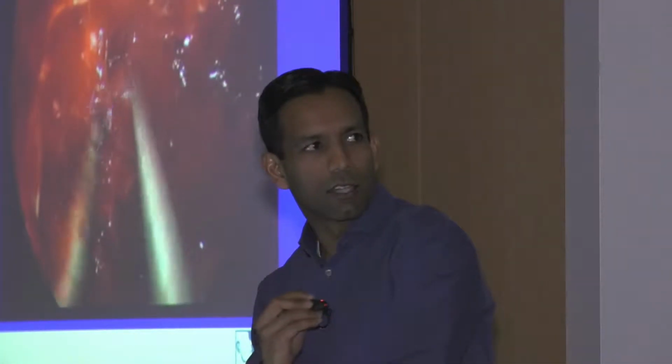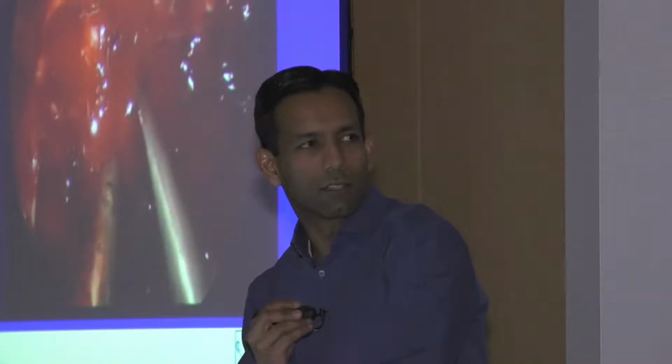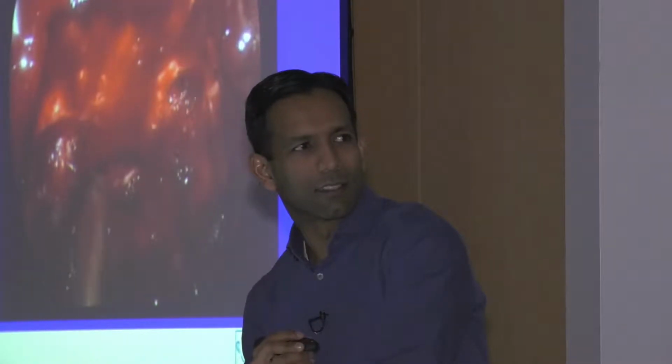And the other critical factor for good endoscopic skull-based surgery is that collaborative relationship we have with neurosurgeons, or in some cases with our oculoplastics colleagues. And we're going to be able to clear that tumor entirely from this area, at least in a gross way. Certainly not microscopic clearance without resecting these structures, but with the tumor on the carotid, that's unrealistic.